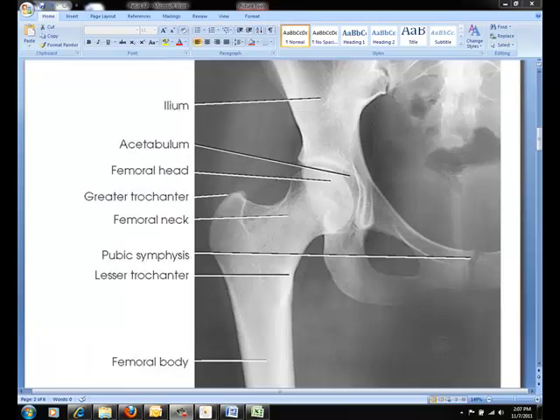When evaluating the image, in addition to the entire hip joint, the greater trochanter should be seen in profile. Any orthopedic appliance should always be seen in its entirety, and also ensure that the entire long axis of the femoral neck is not foreshortened.